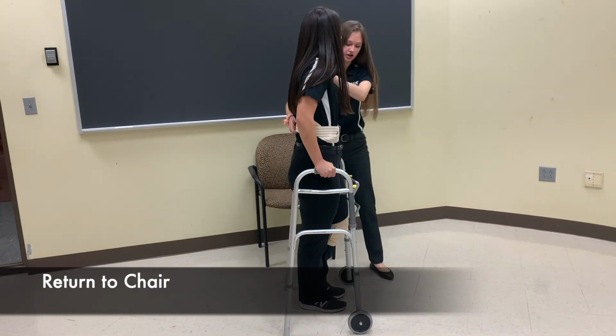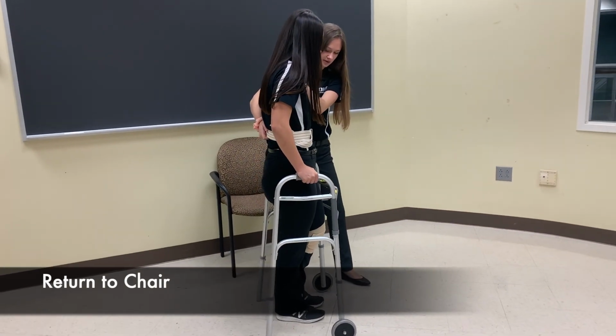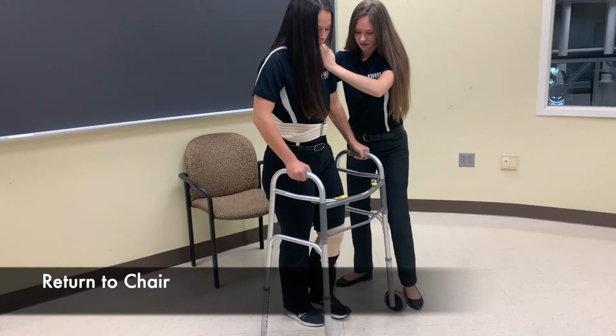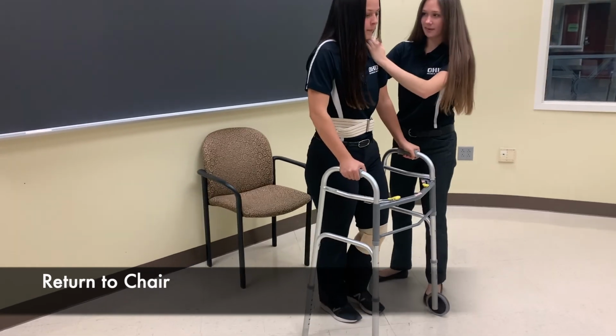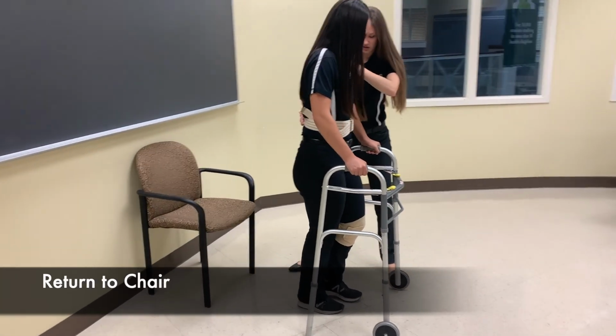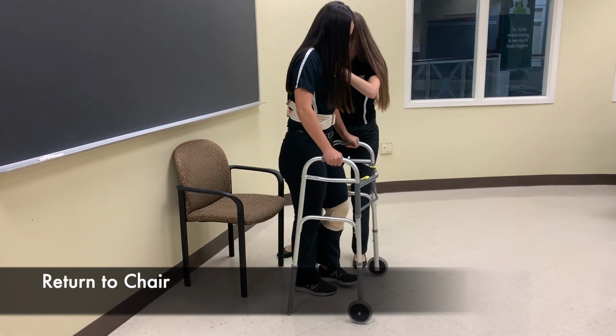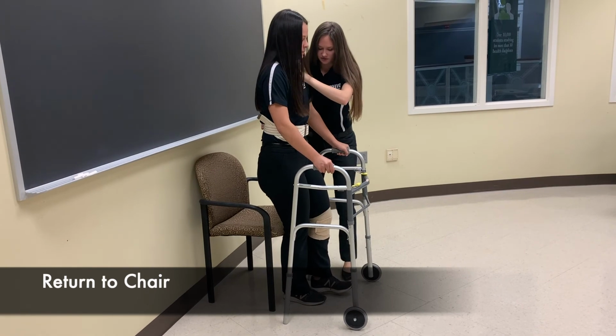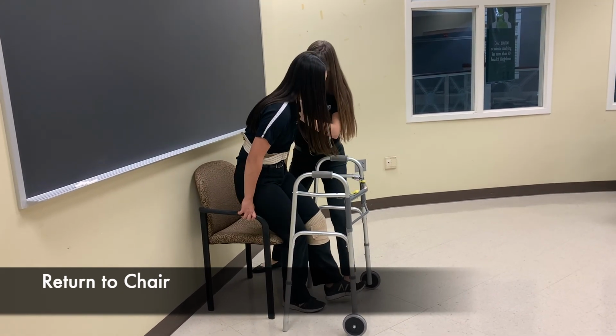Okay, walker, push, walker, push. Okay, so we're going to turn now, so you're going to use your good leg to pivot. So walker, push, walker, push. Now we're going to back up until you feel the back of your legs on the chair. So push, walker, push, walker. Okay, you feel the back of the chair. Okay, reach behind you for the armrests, and I'm going to lower you down.